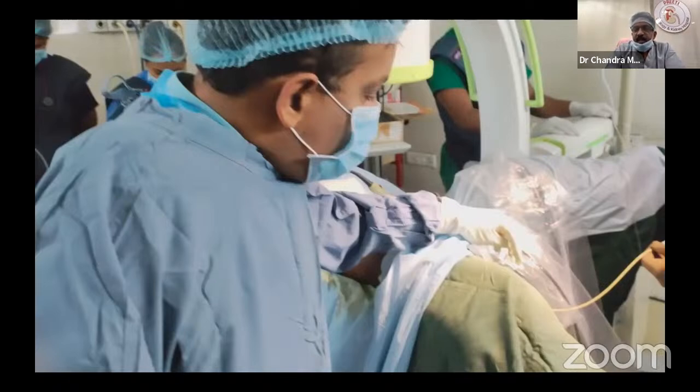In this case, RIRS is feasible. In fact, I was planning to do RIRS, but because of the meaty kidney and, most important, the socioeconomic status of the patient was not such that they could come again and again, we decided that we will give a one-time solution for the patient. Sometimes, yes, RIRS is a little more costly than PCNL because of the equipment and the method of the procedure.